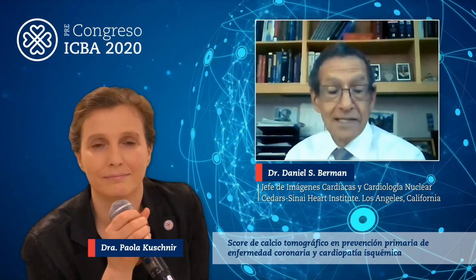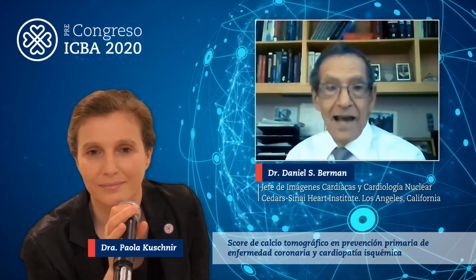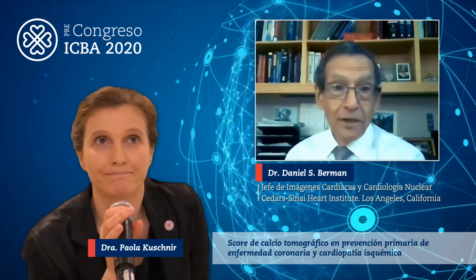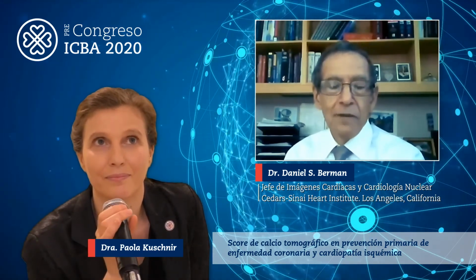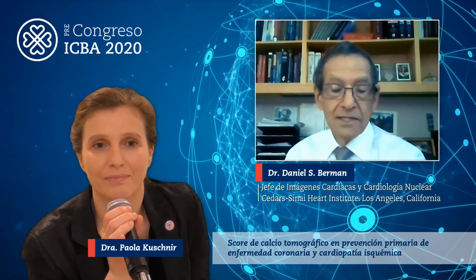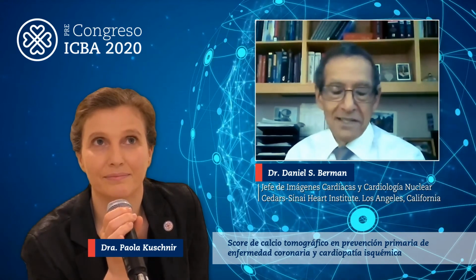And we've tested to see how often patients are on their statins after they've had a calcium scan. It's commonly known that patients often will get a prescription for statins and then just don't take them. But the frequency of adhering to treatment recommendations when the calcium score is high has been demonstrated to be increased.